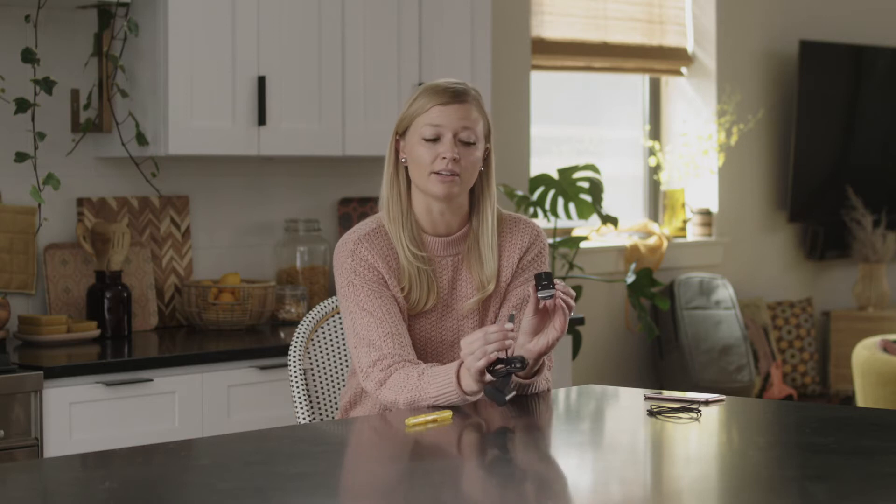To use this device for the first time, you will want to make sure it is charged by using the included cable. The light will be a steady red while charging and will change to a blinking green light when charging is complete.